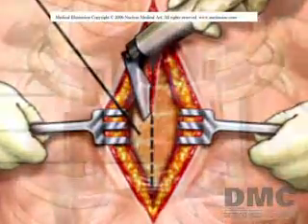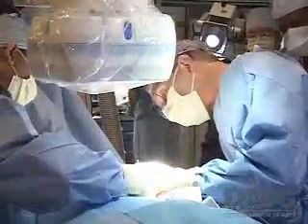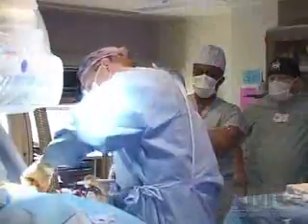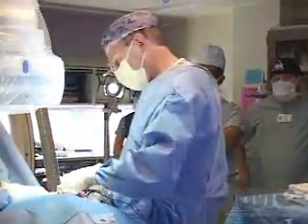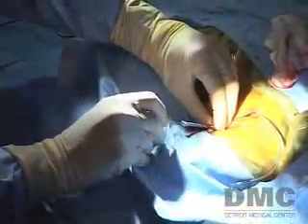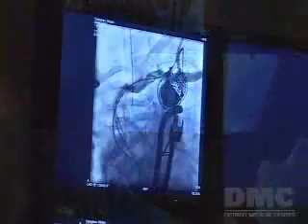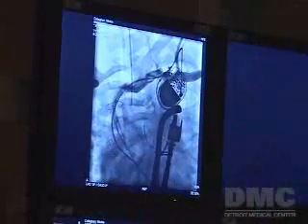In the past, Trinity would have faced highly invasive open chest surgery with a lengthy recovery. But Dr. Karpawich opted for the new FDA-approved thin lead catheter delivery system. It requires only a 1.5-inch incision made to look like a skin crease near Trinity's armpit. Using a catheter, the doctor slipped the new lead, only 1 millimeter in diameter, through a vein into her heart and attached it to the pacemaker.